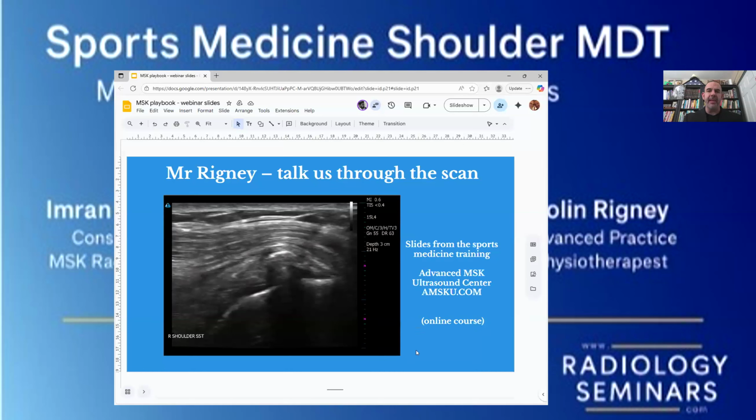Okay, it looks like the tendon is overall intact because we have a fair amount of volume here, meaning the distance from the bone to the bursal layer is maintained. We just have this piece of calcium in here that's like a rope over a rock. It's kind of fraying away at that tendon. You can kind of see the way it's arching through. So whenever somebody moves their arm away from their body, this is creating a shear effect in here, causing a perpetual cycle of inflammation.